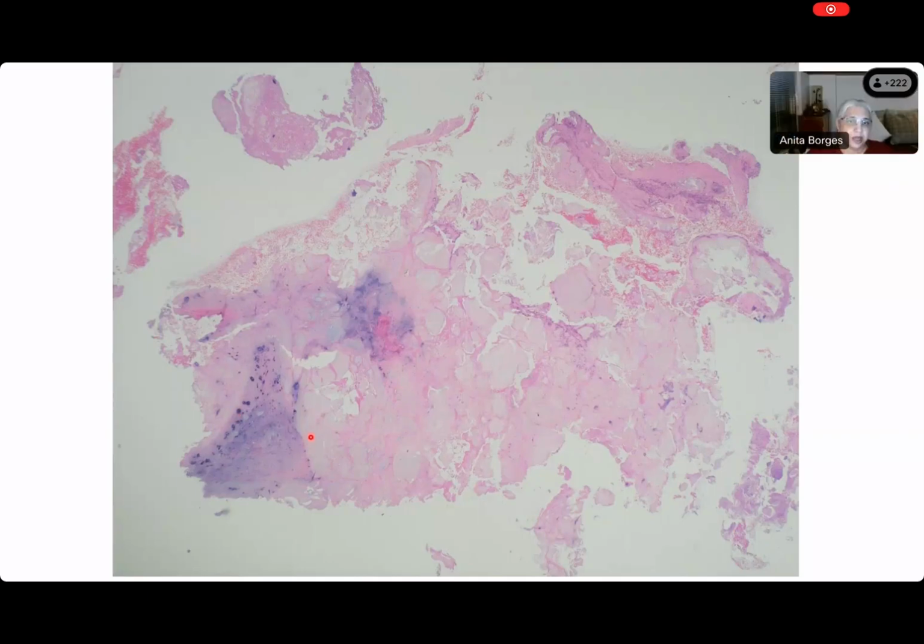Are you seeing myxoid areas and hemorrhagic areas, Mansi? Towards the right side. I can see that. Do you think that this is hemorrhage? When you say that something is a hemorrhagic lesion, what does that mean? Not the lesion per se, but the area over there. Could they do a biopsy without some blood being shed?